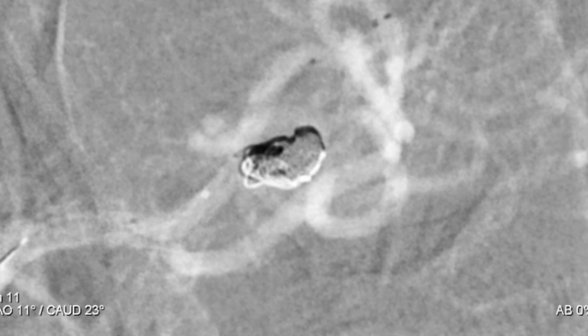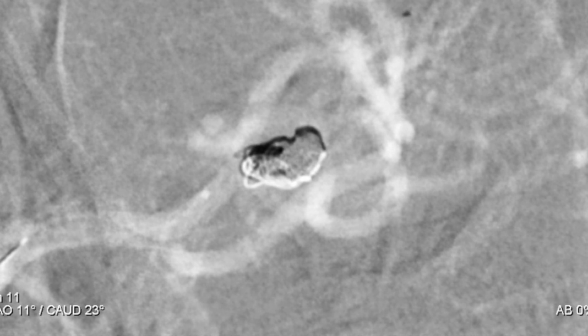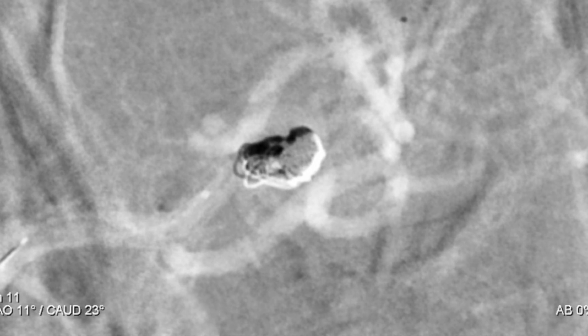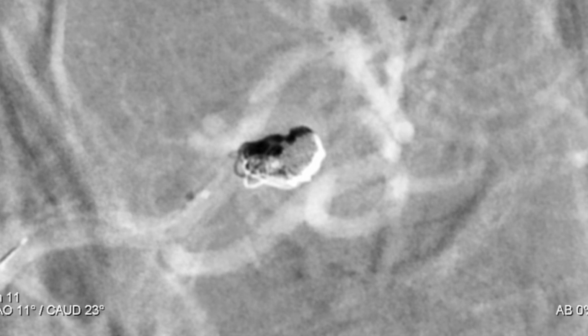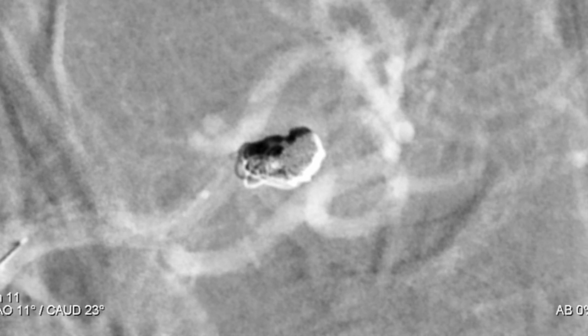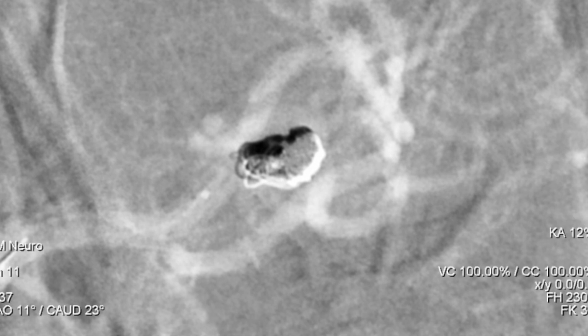The most distal marker is the olive of the pusher of the microstent, and the second and third markers are the markers of the stent. We want to spare the first media bifurcation and implant the stent just along the neck of the aneurysm. And here we have implanted the stent. And now we can pull the microcatheter with the pusher of the stent.